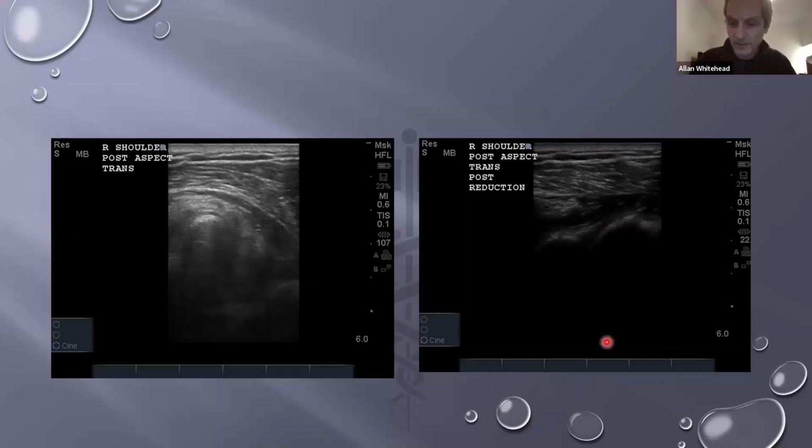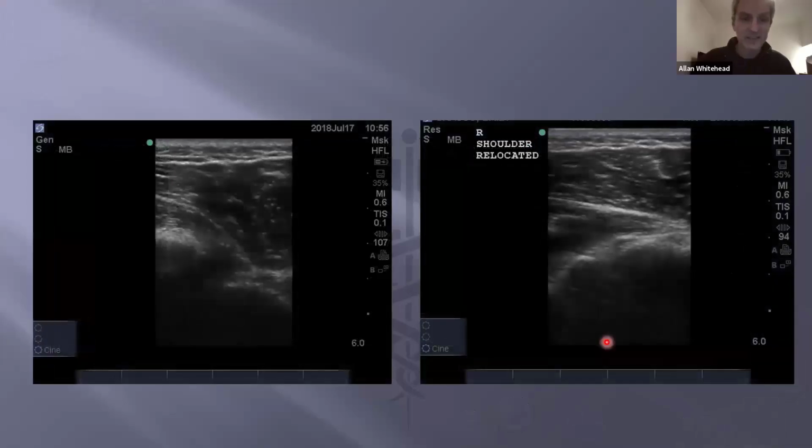So we'll go to the next case. These are all different cases. As you can see, this one's still 4 or 5 years ago, but getting more recent. I haven't marked this one; I have actually marked the side on this one.